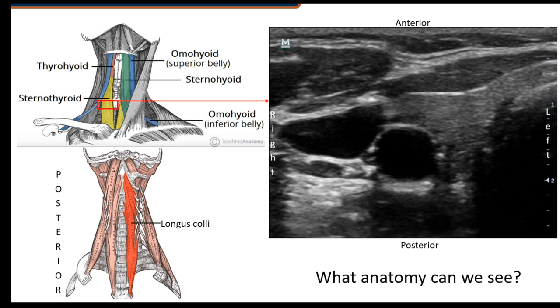Let's bring up an image and talk about what other muscles and structures we can see. This is a transverse scan plane — we're anterior to posterior. Using convention when looking at the thyroid, the toe of the probe should point to the patient's right and the heel leftward. We have the image of the trachea right here. We have our neurovascular bundle — the CCA and the IJV. What I haven't talked about is that other structure that runs with it, and that's the vagus nerve — cranial nerve 10 — which rides right along with them, all enclosed within that tight carotid sheath.